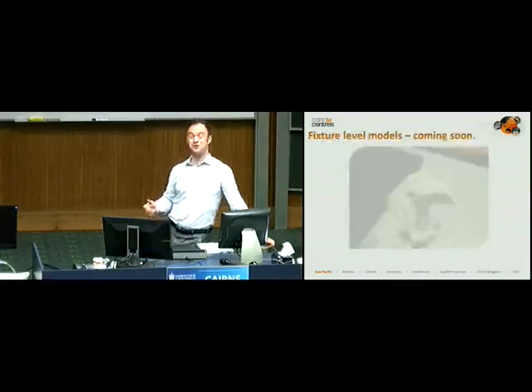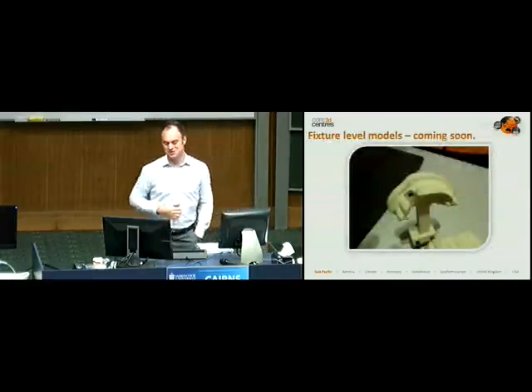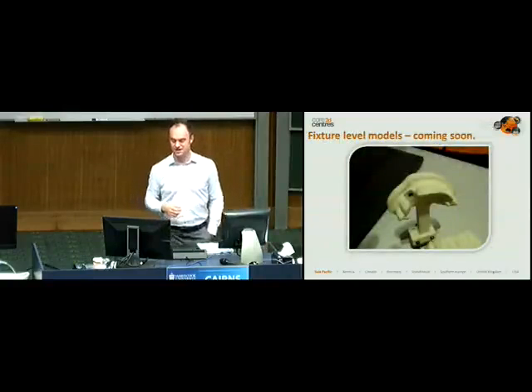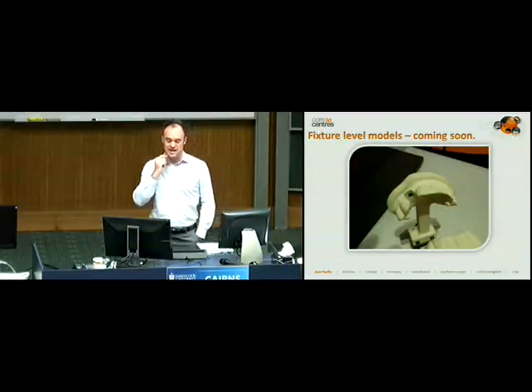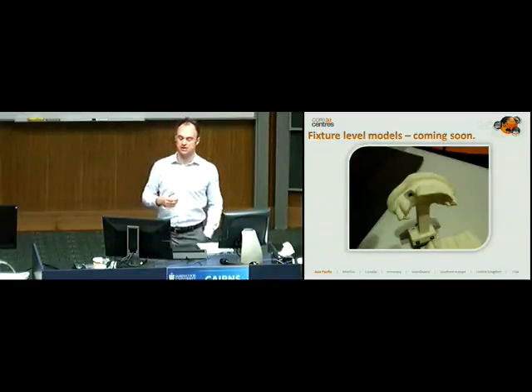So I did say I wasn't going to talk about the future, but I'm going to just for a second. This model you see on the screen, sorry about the picture, I wasn't allowed to take the picture, but I did anyway. It's taken at one of our research and development laboratories, and I don't know if you can see that very clearly, but it's like the anterior model that I just showed you on the viewer, but it has actually a soft tissue component and an implant or a fixture in there. So we actually can screw on what's called a scan cap. It's like an impression coping specifically for the digital scanner. Scan that, and that then gets translated into the model. So this is the iTero one created on the Haas machine.